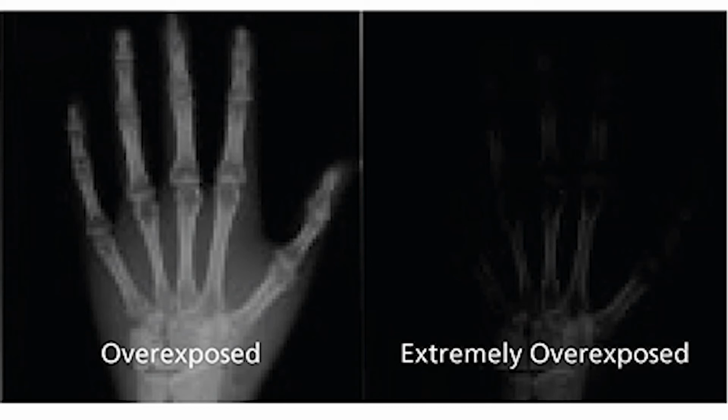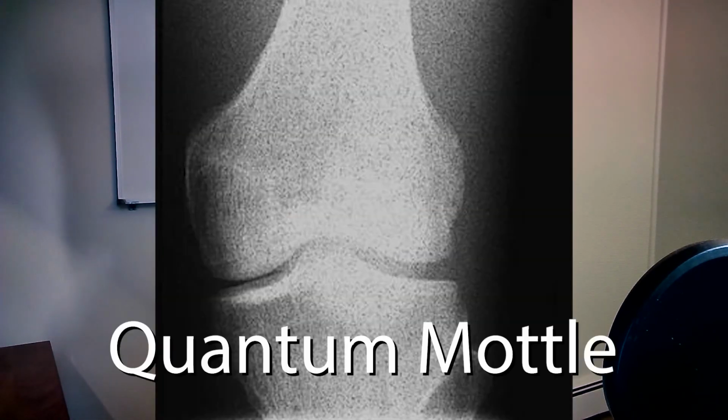So to summarize, mAs stands for milliamperage seconds. It's the product of the milliamperage and the time, or the seconds. mAs controls quantity. Now, it's important to choose the right amount of mAs for your image. If you choose too much mAs, which means that you create too many photons, then your image appears burnt and blacked out. If you choose too little mAs, or you're producing too few photons, your image gets a fuzzy, noisy look, and that's called quantum mottle.